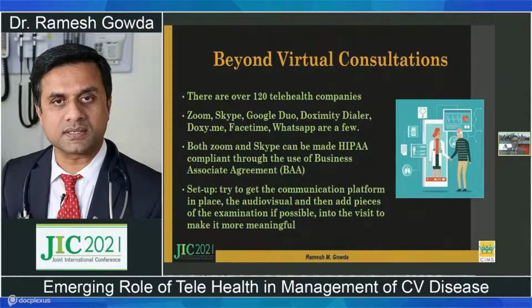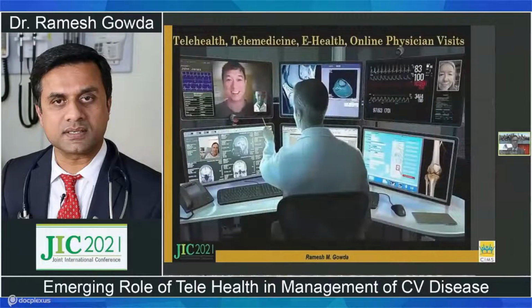You try to get a communication platform in place, the audio-visual, and then add devices to the examination if possible, and make the visit more meaningful. And this is just an example of how a physician can talk to a patient and share data, including imaging, a live ECG and monitoring, and still be able to consult other physicians, other providers, and still get effective care.